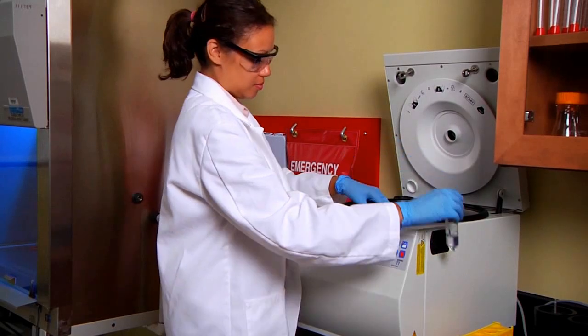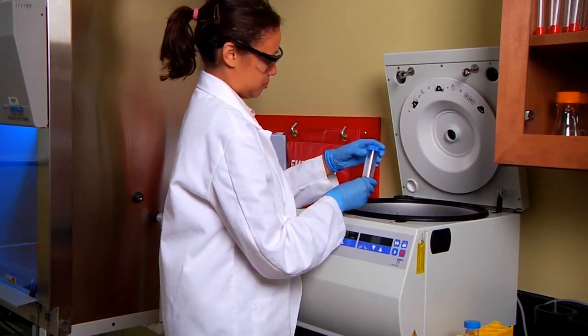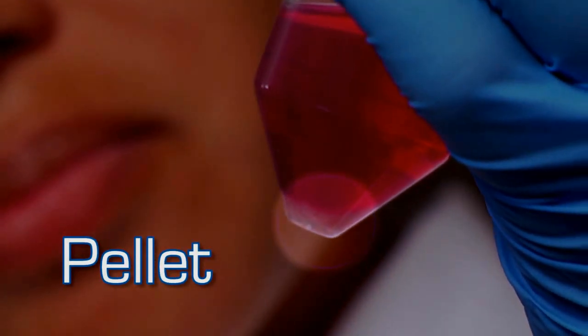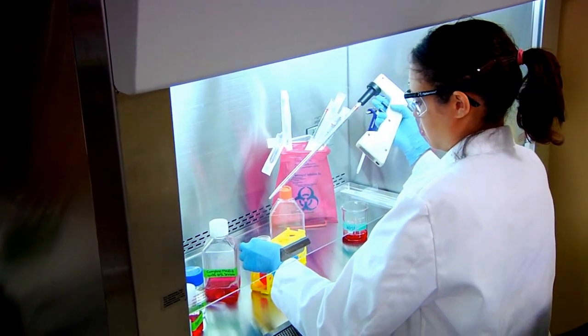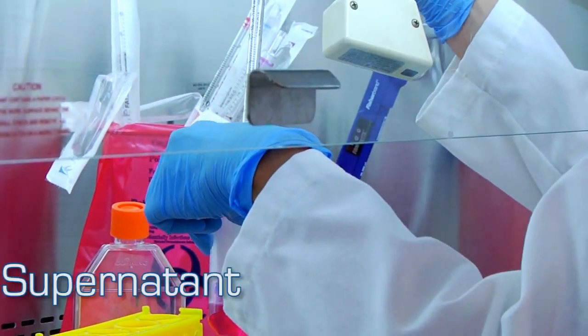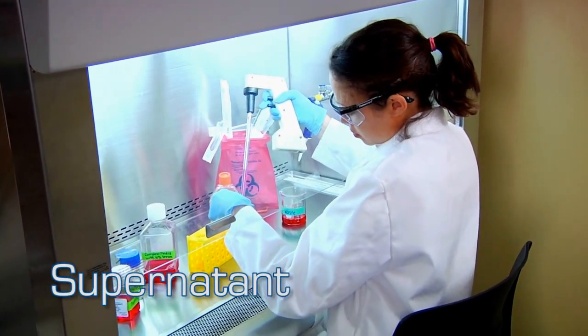Once the cells have finished spinning, look for a pellet at the bottom of the tube. Hold the tube steady, because shaking the tube can displace the pellet. Use a pipette to carefully remove the supernatant, which is the liquid above the pellet.